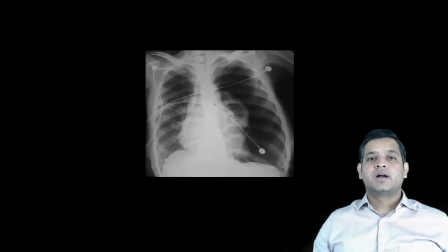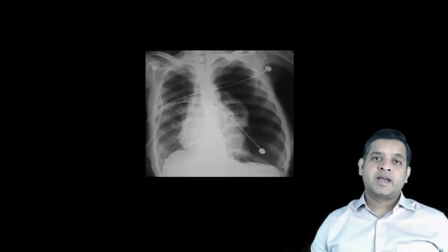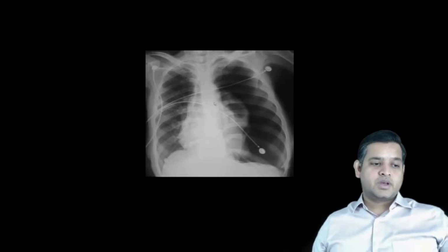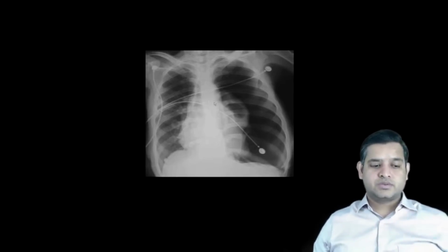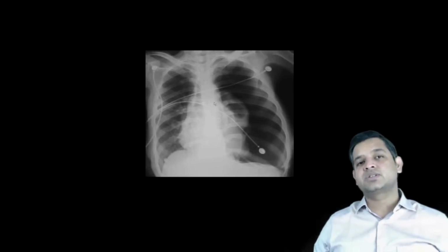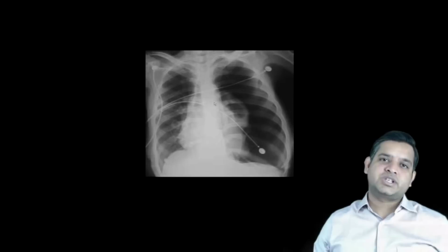All right. Apart from the neuro, another image that examiners are very, very fond of is the chest X-ray. In your exam, you're gonna see at least 4 to 5 chest X-rays.